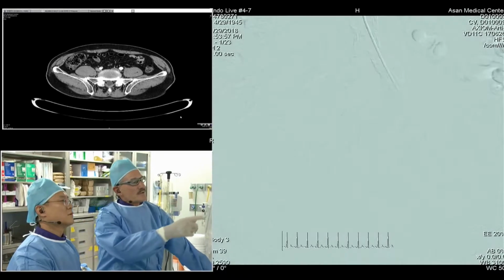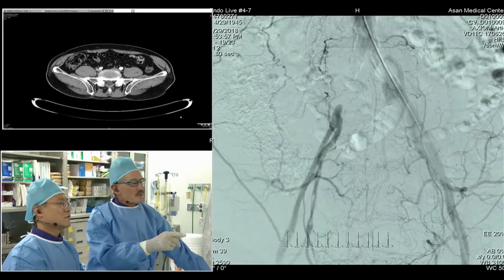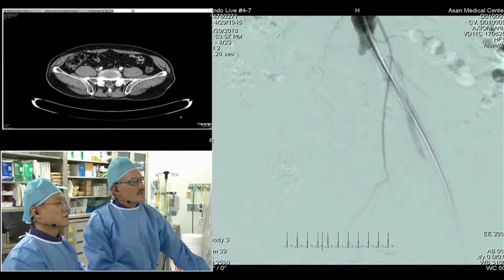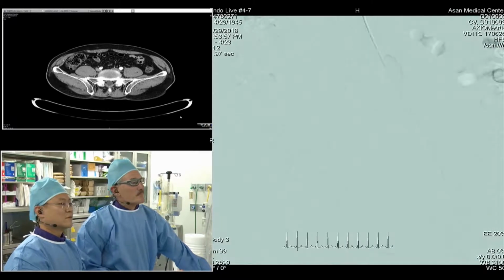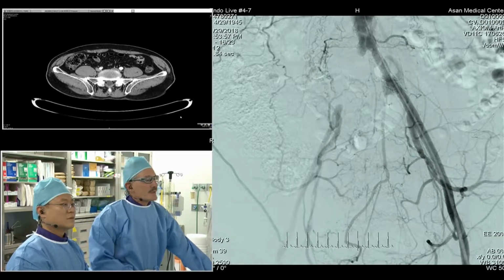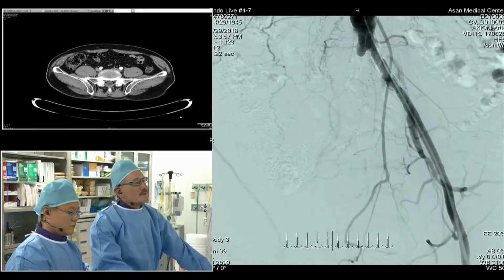And then if we can go to the angiogram here, what we have done so far is just put a 7 French sheath in the contralateral left common femoral artery, and we've done a power injection angiogram. Is that displaying for you there? Can you see our angiogram? Yes, we clearly see the angio, and relatively short occlusions with the stump.